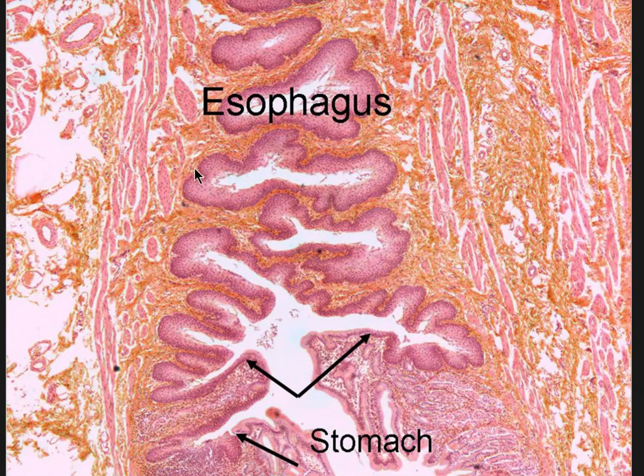and quiz yourself. Here's the gastroesophageal junction again. And like I said, once it's really, really zoomed out, you should still be able to tell, boom, very thick, stratified squamous. And then all of a sudden, when we get to here, boom, very thin looking simple columnar epithelium.